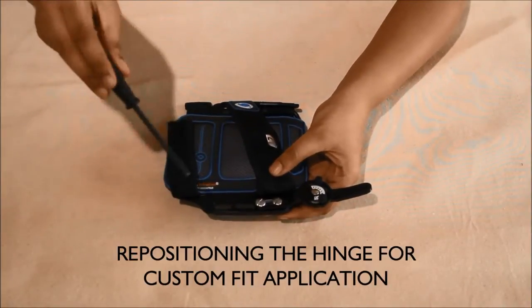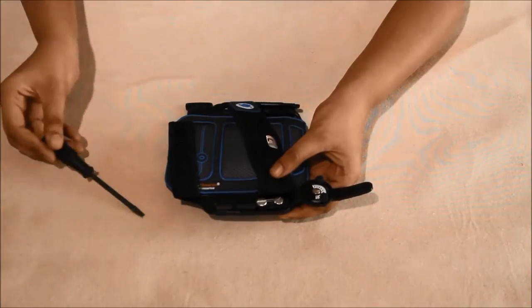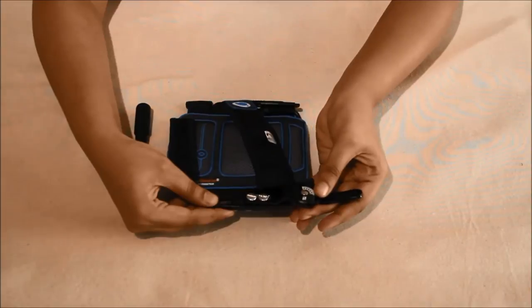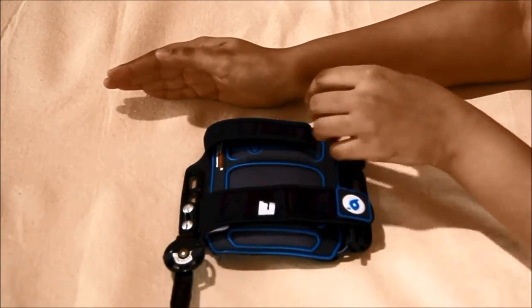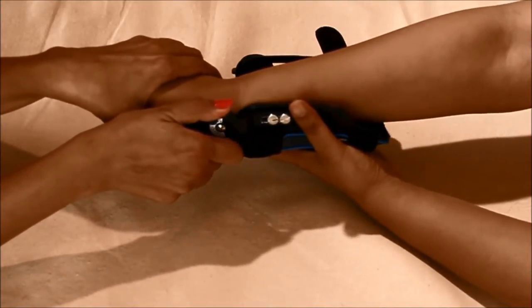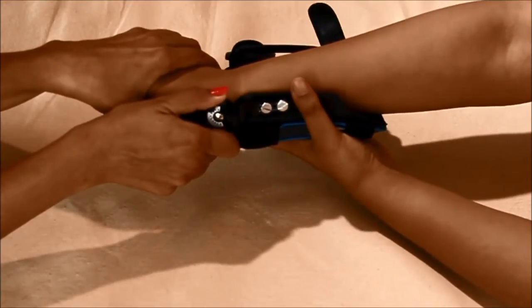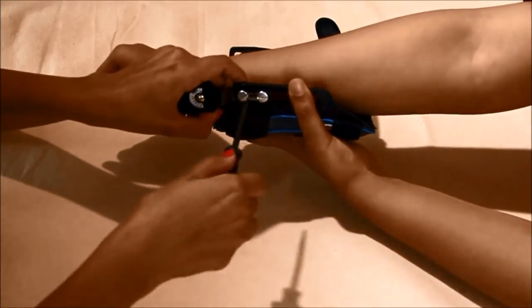Repositioning the hinge for custom fit application: loosen the slot pan head screws to adjust the position of the hinge by moving it along the hinge rail on the wrist wrap main body. For proper functioning, align the axis of the hinge distal to the peak of the radial styloid. Then adjust the position of the cooling/heating points one inch distally along the wrist and palm, and one half inch proximally, while retaining the alignment of the axis of the hinge. Once done, tighten the two-part screw with a screwdriver.